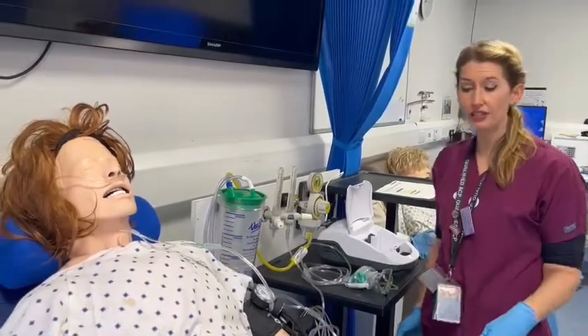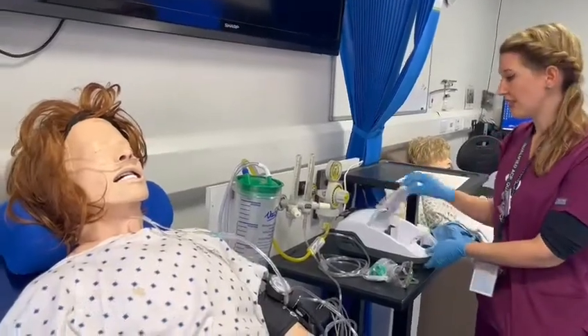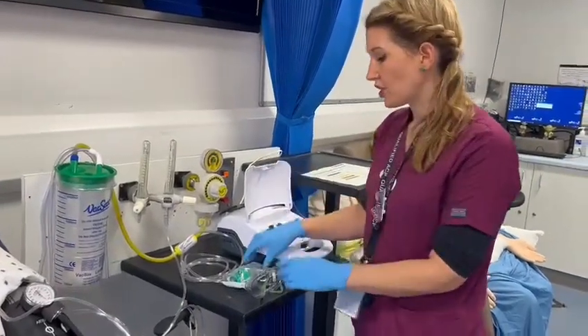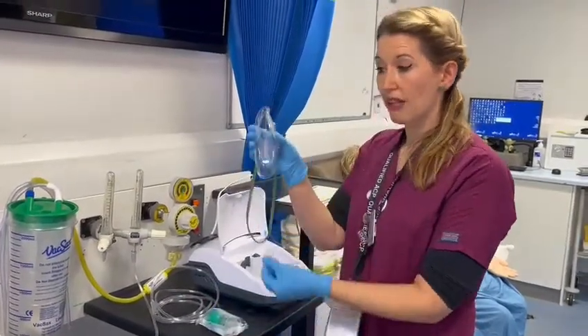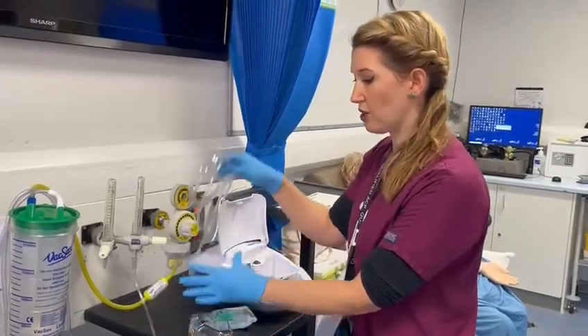We've got a patient here who's needing oxygen, and in order to deliver a nebuliser you need one of these air-driven compressor machines, which you'll be able to get from the equipment library. You're going to need your nebuliser chamber, one of your masks with the simple clear port on the end, and you're going to need some oxygen tubing.